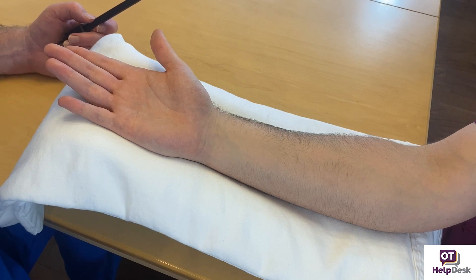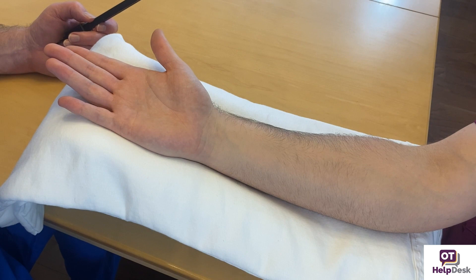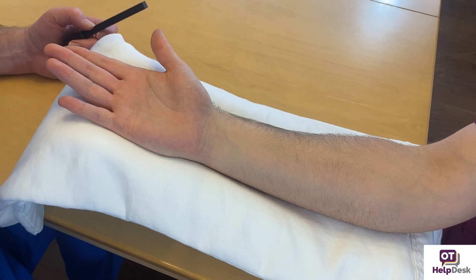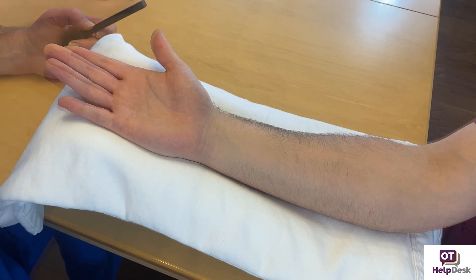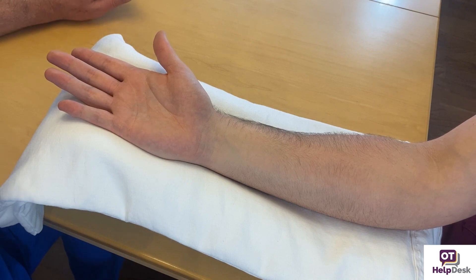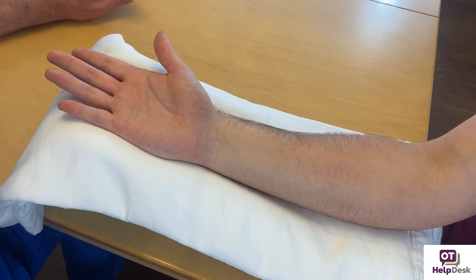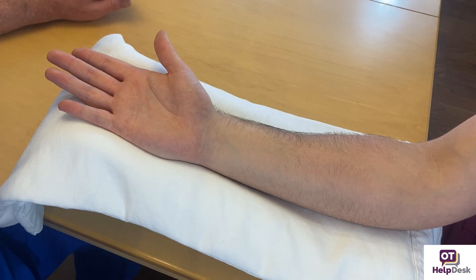Sometimes it's interesting because when a nerve is rejuvenating over a period of time, all of a sudden the patient will get feeling back in the tip of their finger.